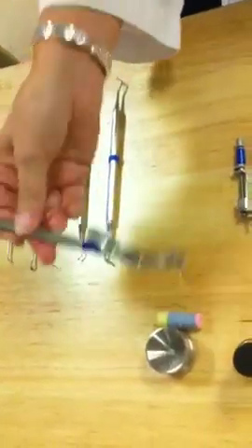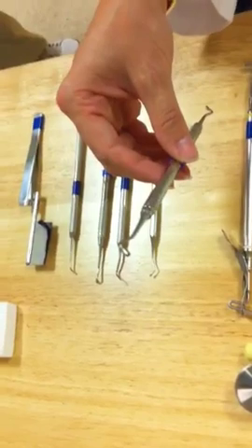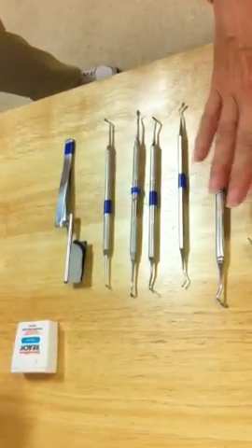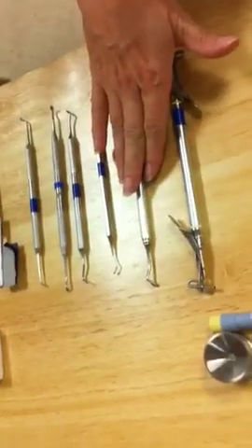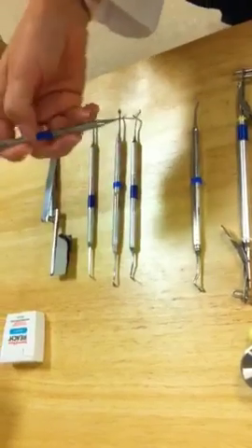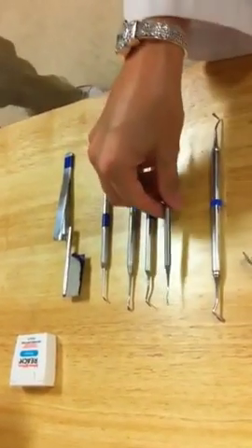Using the amalgam carrier, going to pack it all in, pass this to the doctor, and pass him the condensing instrument, which will condense the filling into the cavity prep. And you're going to be passing him back and forth the amalgam carrier and the condenser until the doctor is satisfied that it's been filled. You're going to use the acorn burnisher to carve any anatomy on the top of the tooth.